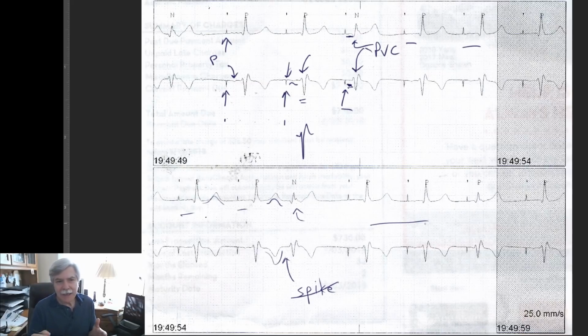Well, at first, let's talk about pacing and pacemakers and how pacemakers work. So can you figure out if this is a dual chamber or a single chamber pacemaker? Well, it's almost certainly a dual chamber pacemaker, because single chamber atrial pacemakers are very, very rare. In the US, basically nobody puts them in. In Europe, perhaps in someone with pure sick sinus syndrome, it might be an option. But here we're always worried that, well, what if AV block occurs, and you want to have that ventricular lead there as a backup.